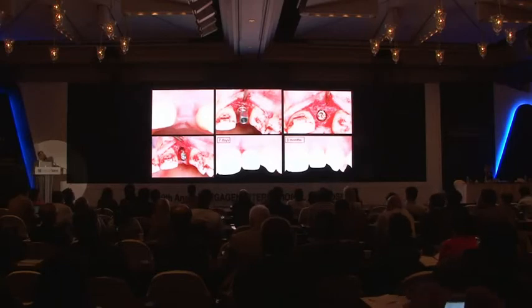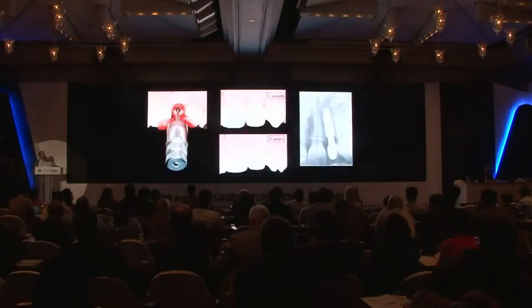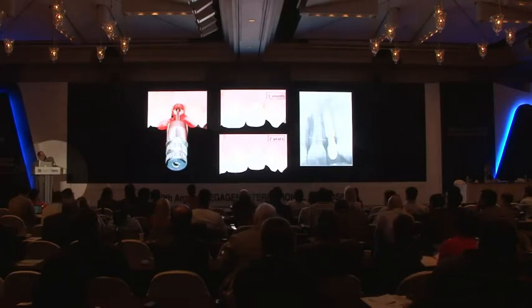We used immediate loading with a conical profile abutment. The final restoration and the check after 2 years demonstrate that we did not have resorption of the crestal bone and no loss of the soft tissue, even if the implant was so close to the teeth.